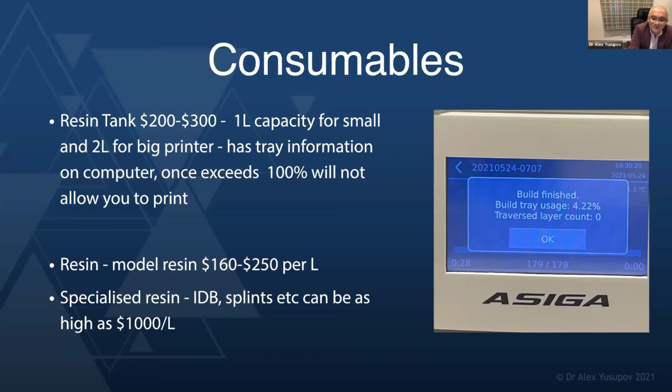Like inlay material or composite restorative material, which I've just used recently. It's beautiful material, but the 500 ml bottle cost me about $1,000. But that 500 ml bottle can probably do hundreds of little inlays and onlays. So it will provide a lot of use.